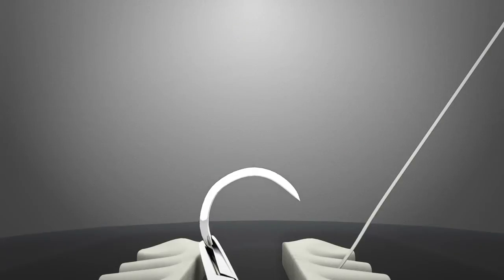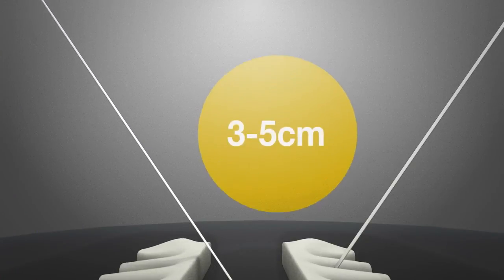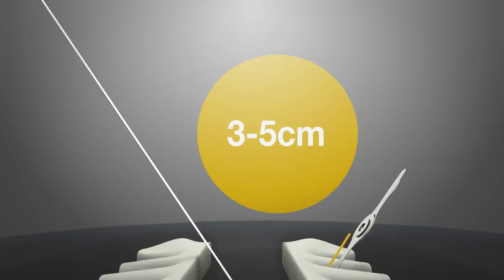The device is then pulled in a strong but smooth fashion through the tissue until the hub is approximately 3 to 5 centimeters above the tissue. Pulling the hub to this distance will make tensioning the strap easier.